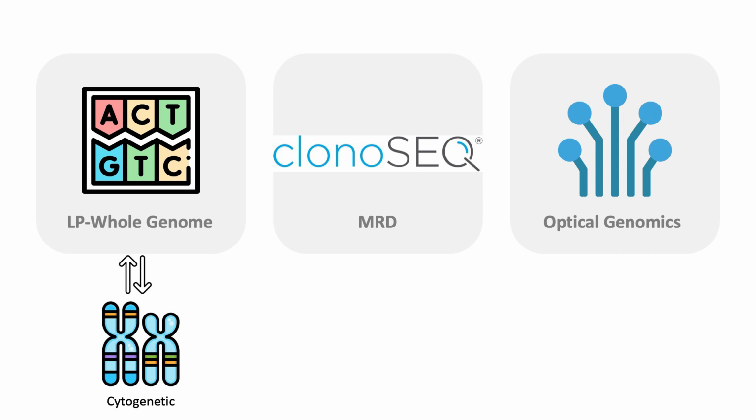So let's start with the low-pass whole genome. What does low-pass mean? The key is low-pass. The average sequencing depth in hereditary diseases is usually 100, enough to call a mutation in germline mutations. For somatic, usually you want 500 to 1,000, or even deeper if you want to go for MRD. Low-pass is 2 to 4 coverage.